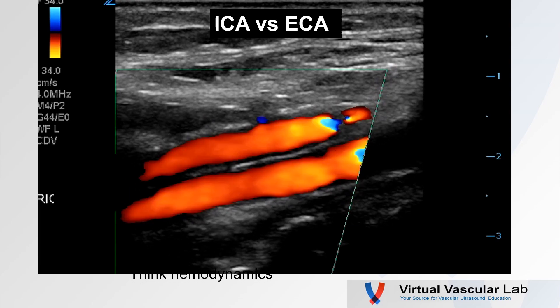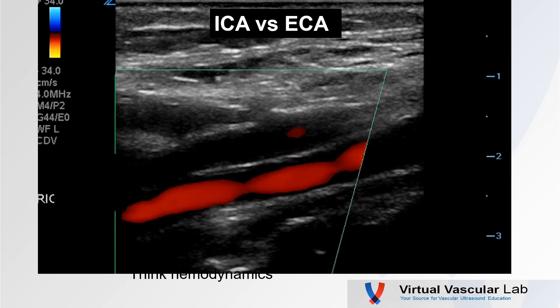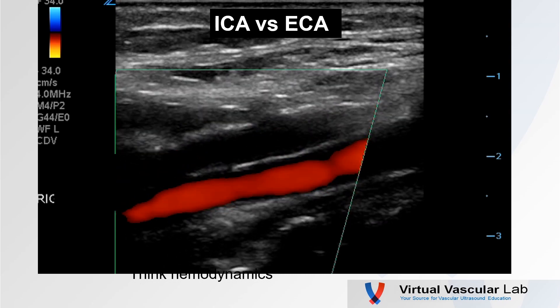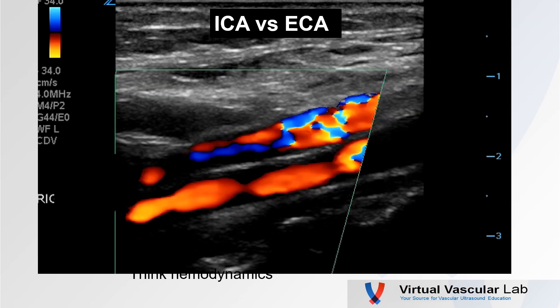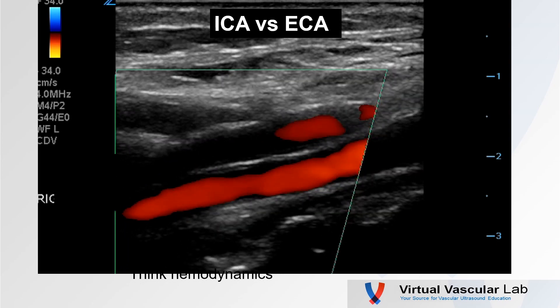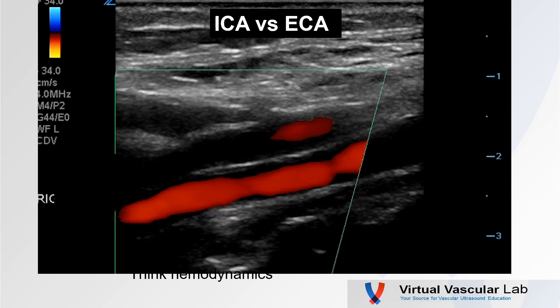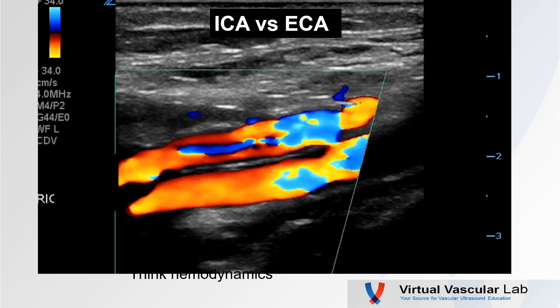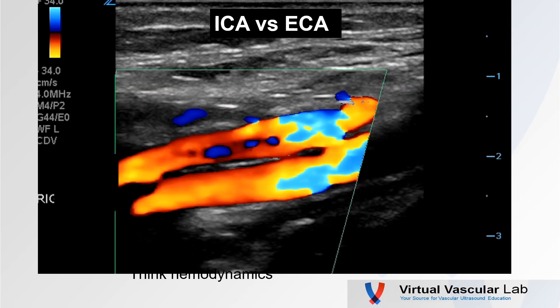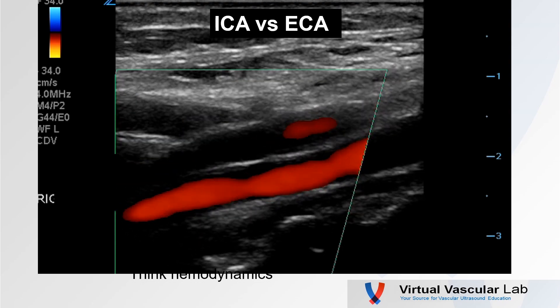How about one more quiz? Always thinking hemodynamics — two vessels here. Which one is the internal and which one is the external? The one on the bottom is the internal: low resistance flow — look at all that diastolic flow. Whereas the vessel on top has little or no diastolic flow — high resistance. This is the external. Always think hemodynamics.